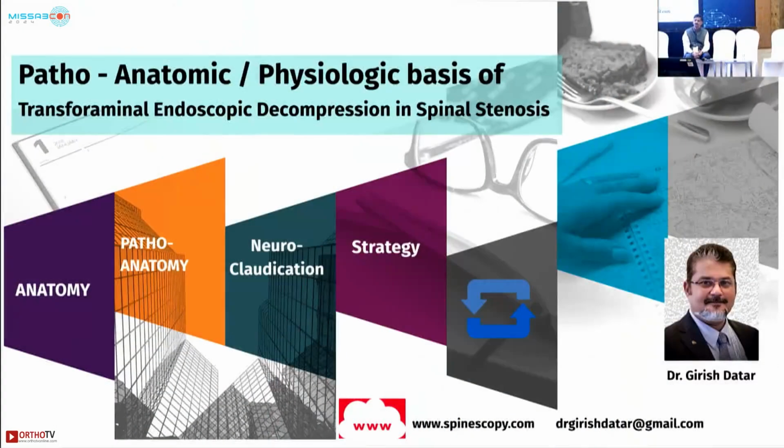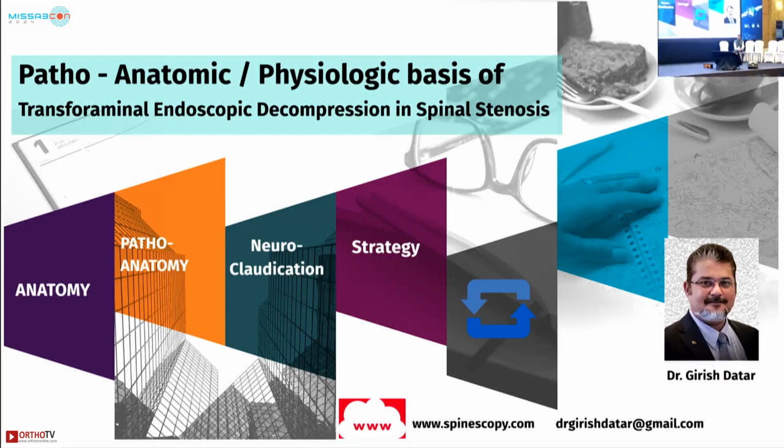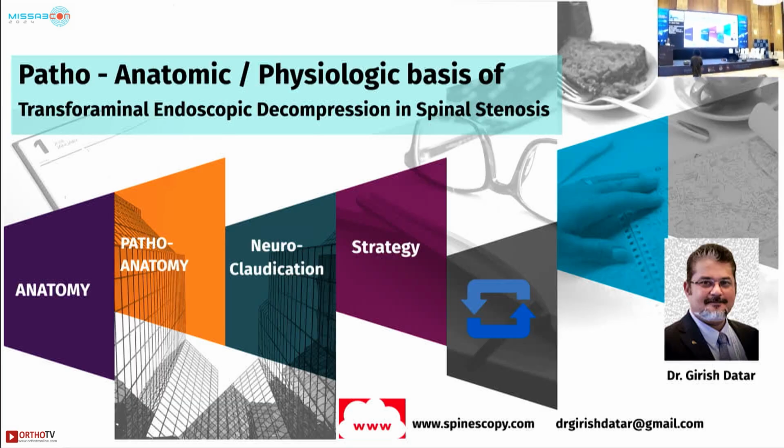Well, I'm talking on quite a controversial topic of transforaminal endoscopic decompression of stenosis. Now, in regular stenosis, where patients are fit to undergo a surgery in a routine way, then naturally we choose an interlaminar route. But there are situations with the growing and the aging population that we are most of the times forced to undertake a surgery under local anesthesia. So in the majority of even younger patients who have unilateral lateral recess stenosis or unilateral stenosis, unilateral symptoms, we can choose transforaminal decompression of stenosis, provided one is comfortable in performing it.